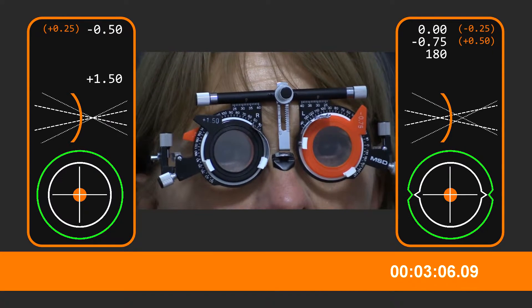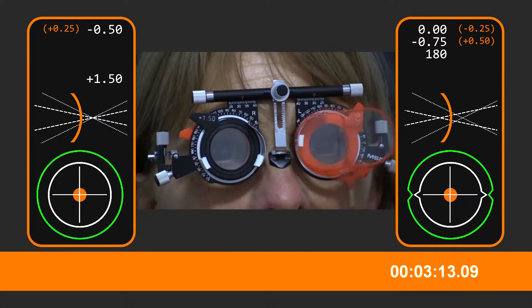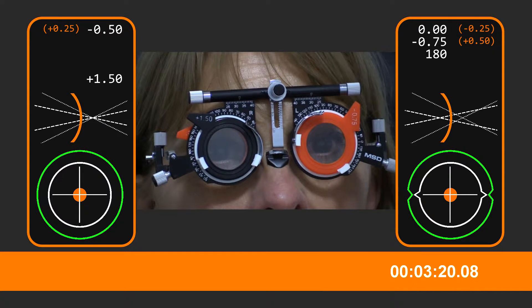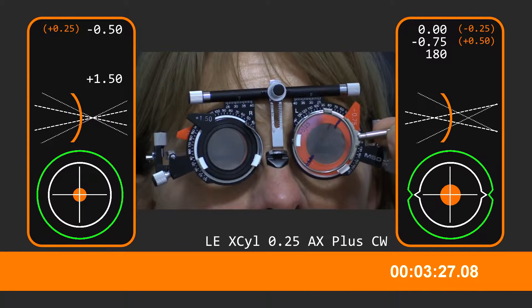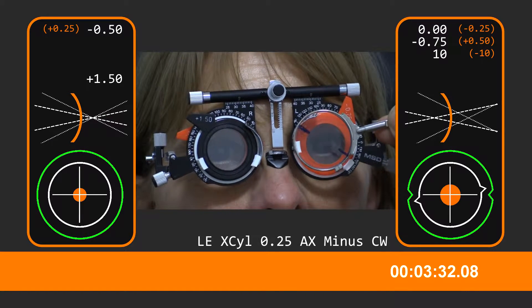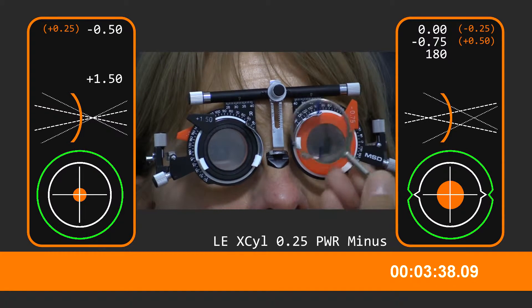See the R, the top RZ line — is it clearer with that one or clearer without? Without. Without. With this one? Without. And have a look at the spots there — which is clearer, first one or second? First. First one. First one. Second. First one. Second.